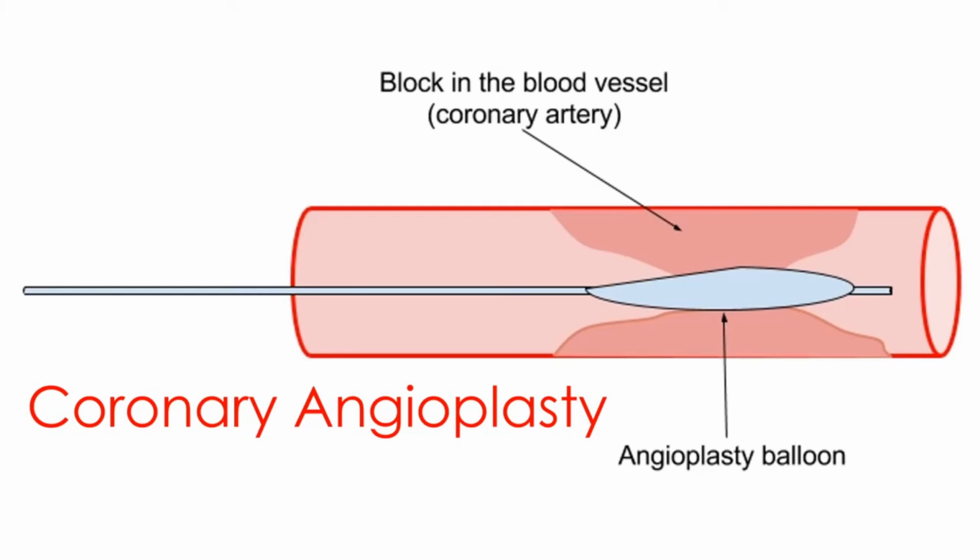In addition to the good blood flow to the vital organs provided by ECMO, another advantage of ECPR is that rapid cooling of the body for protecting the brain is possible due to the availability of a heat exchanger. As a good blood flow is maintained even during cardiac arrest, doing a coronary angioplasty when the heart is in standstill is facilitated by ECPR. But ECPR is costly, needs a lot of technical support and availability is low.